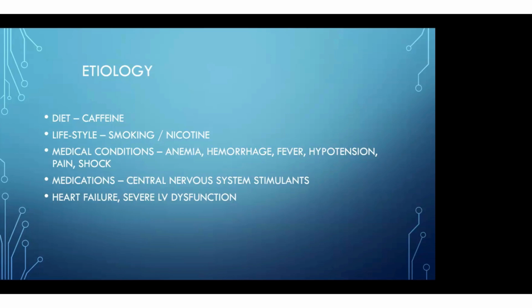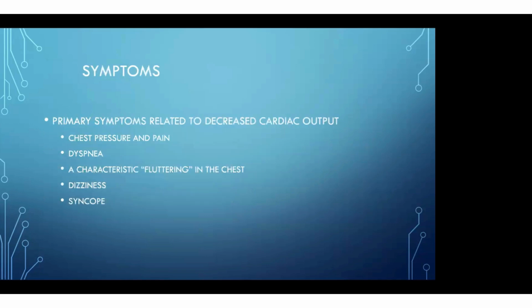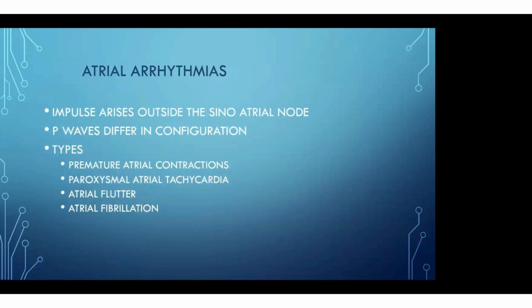Don't search for the arrhythmia, look behind the arrhythmia. It will be a secondary problem which is causing the sinus tachycardia. So this is very commonly found in our clinical practice. So that's all. Then we will go to atrial arrhythmias.